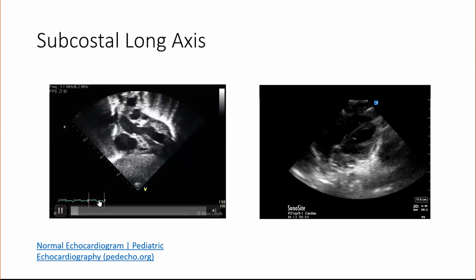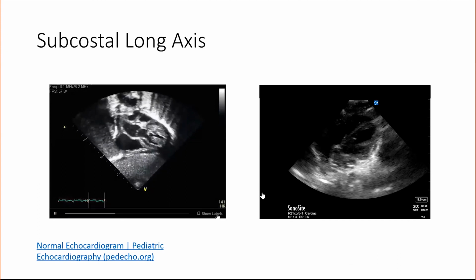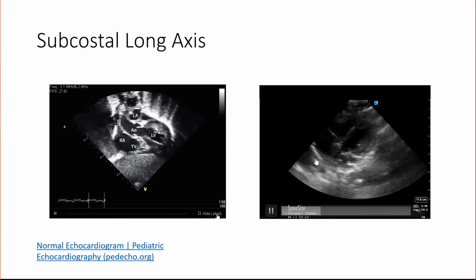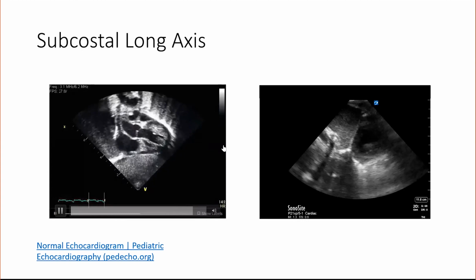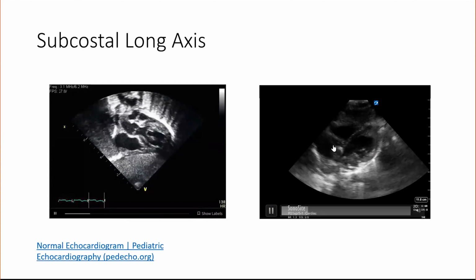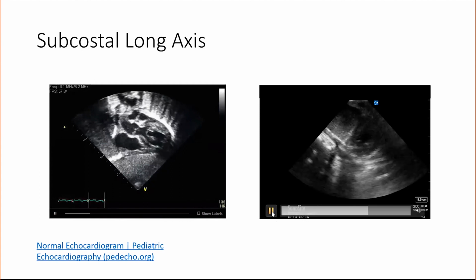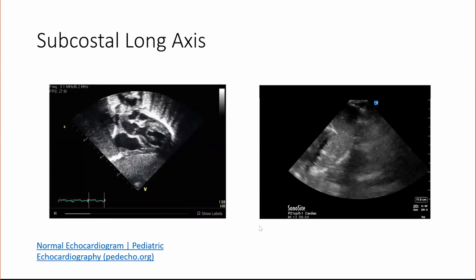And this is the image obtained from the pediatric Echo Atlas. And this is what I have obtained during a focused view. You can see a little difference in the orientation. The pediatric echoes are always flipped like this, and adults or the ED obtain it in the same plane, but here you see this as a right atrium, right ventricle, left ventricle, and left atrium over there. And then I've rotated it so that it looks like a short axis view also here.